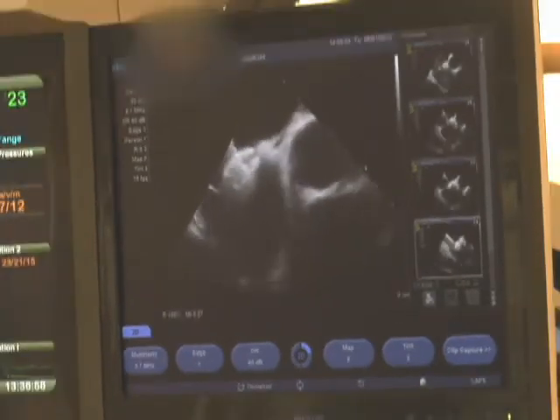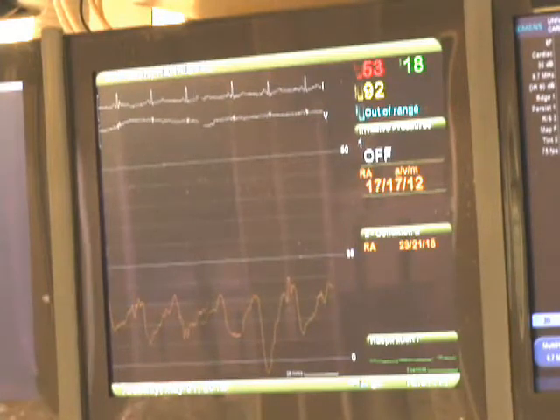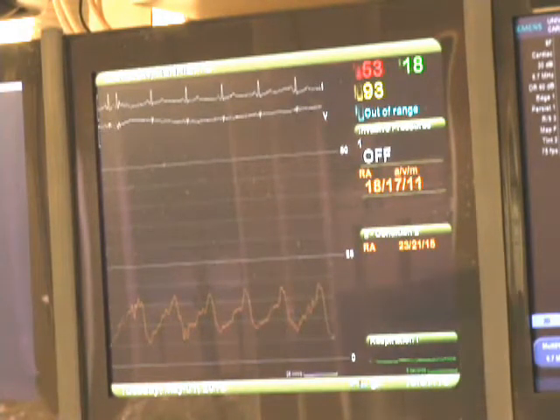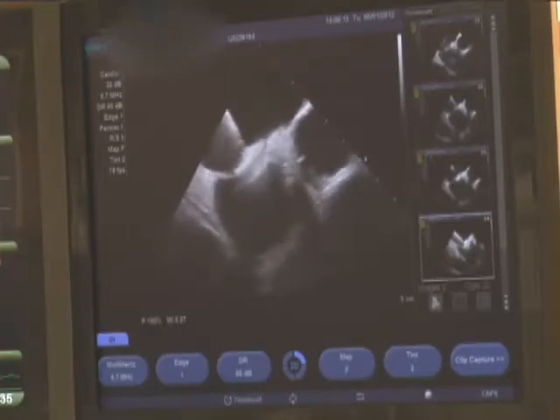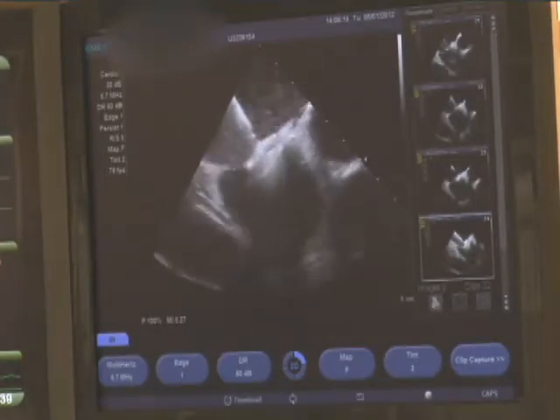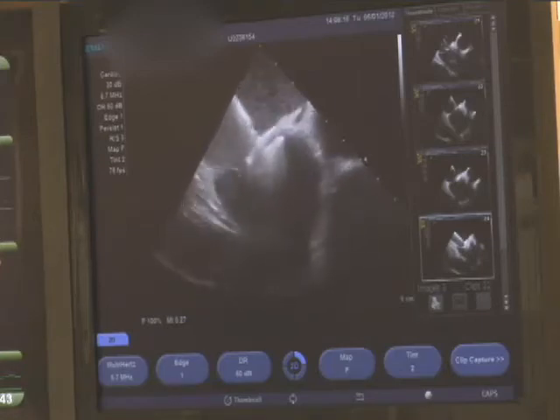With both discs deployed, oxygen saturation in the left atrium is noted to increase due to closure of the right to left flow, and right atrial pressure is again recorded. A saline contrast study is repeated at rest and with Valsalva release to test the occlusive nature of the device. Unfortunately, a small superior leak is still present.